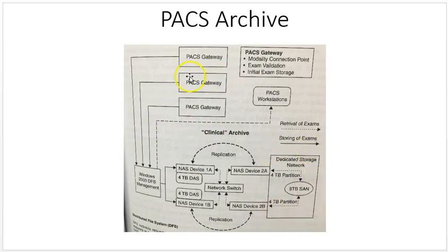So again, just to repeat, in their configuration, you have the DICOM servers going through the IMS, then sending to the NAS. The NAS has 2 sides. It's backed up and replicated, and then into the archive. Inside this box would also be the database server. So that is one possible configuration.